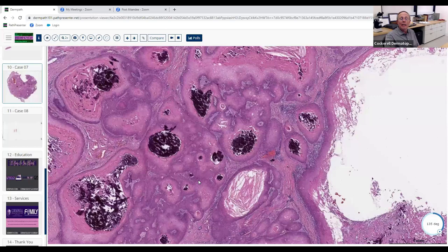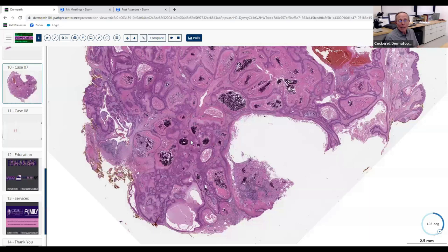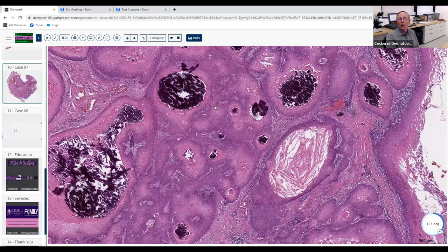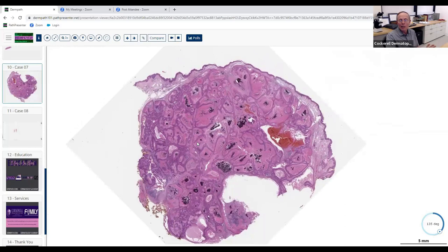If you leave these lesions alone for 25-30 years they can undergo malignant degeneration — but that's not common. The most important thing is you don't look at this and say there are bulbous aggregations of cells with some mitotic figures, therefore it's cancer. At low magnification it has all the architectural features of a benign lesion. This is completely benign — just like you don't want to over-call pemphigus vegetans with pseudocarcinomatous hyperplasia as cancer.